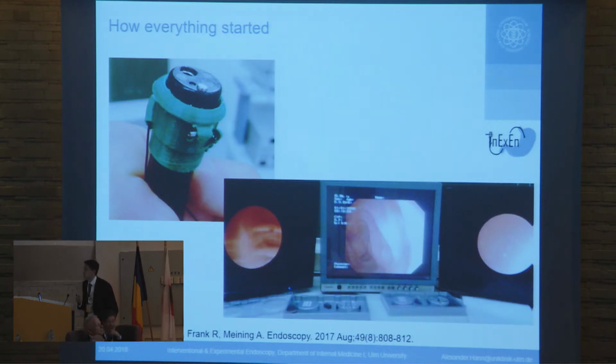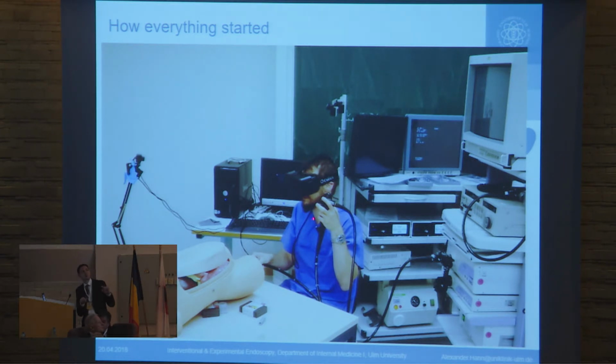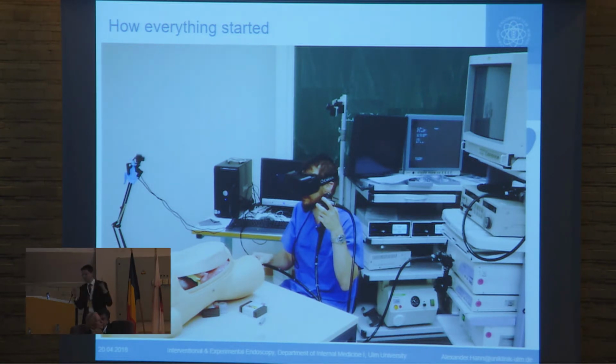So we were thinking about how to improve this new method, and this is where virtual reality came into place. So what I did, I programmed a little program where all of these 3 monitors got fused and simultaneously presented to the endoscopist, in this case Benjamin Walter, one of my colleagues, on very big screens. So this is how we started using this new technology.